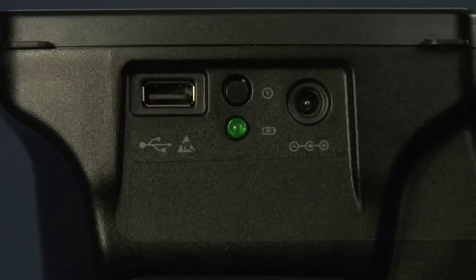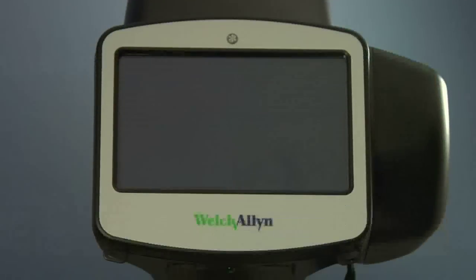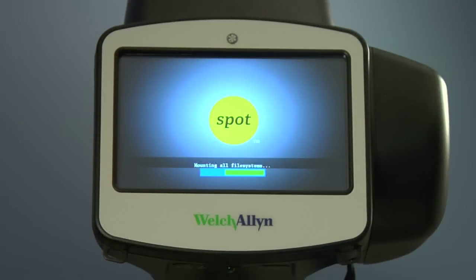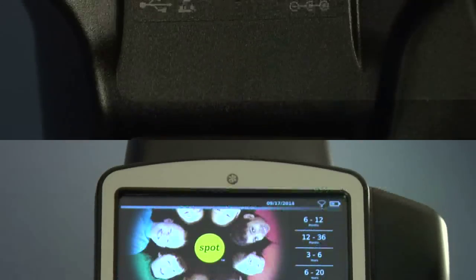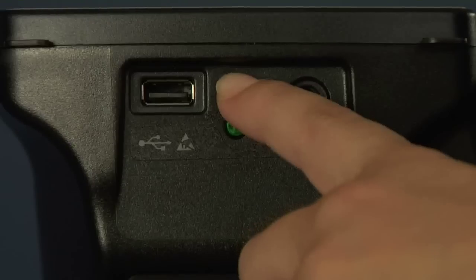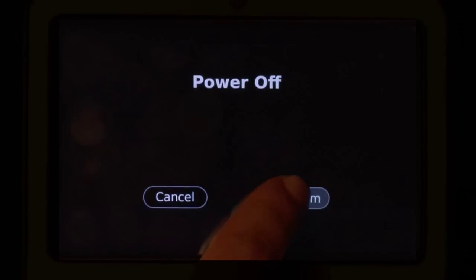To turn the vision screener on, press and release the power button. The startup process takes approximately 30 seconds. Once powered on, you will see the main menu. To turn the device off, press and hold the power button for 2 seconds. A confirmation screen will appear to confirm shutdown.